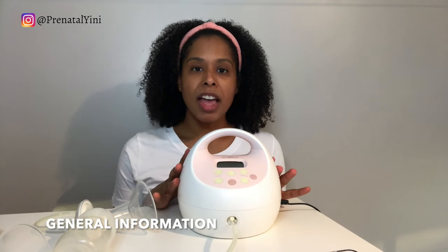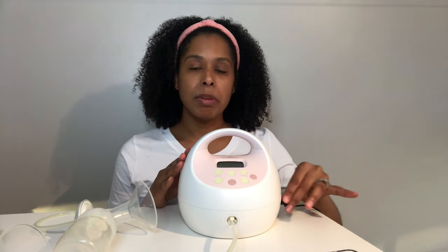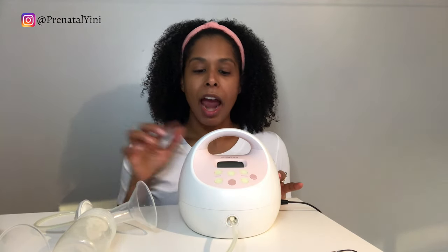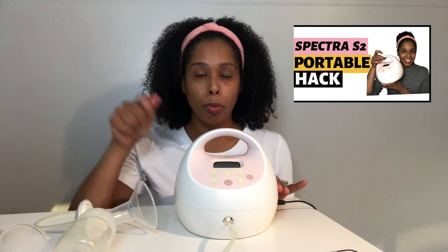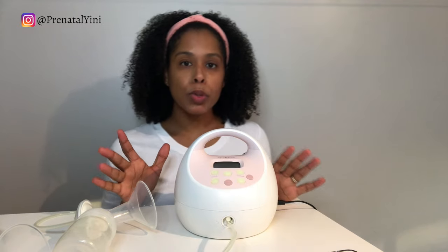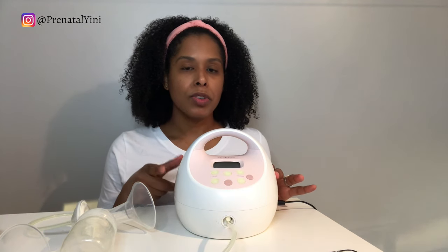The Spectra S1 is the blue one and the Spectra S2 needs to be connected to an outlet. The Spectra S1 has a rechargeable battery. I recently made a video on how to convert the Spectra S2 into a portable breast pump. They're both closed system breast pumps, which means the backflow protectors prevent milk from flowing into the tubing and into the motor.